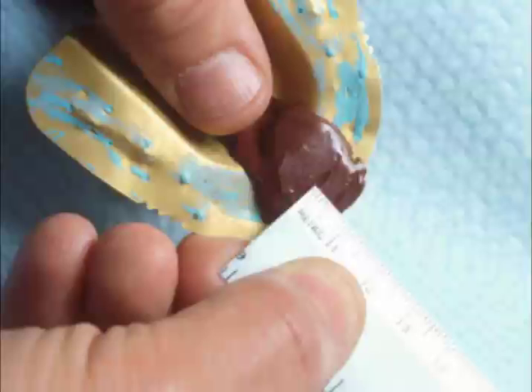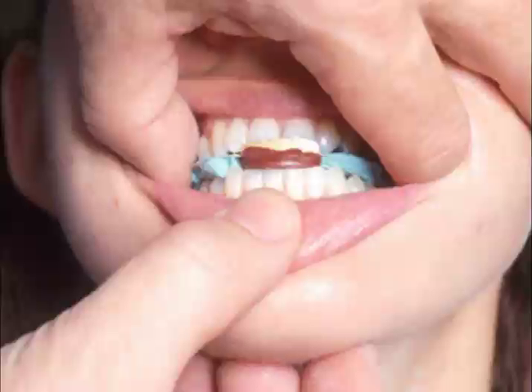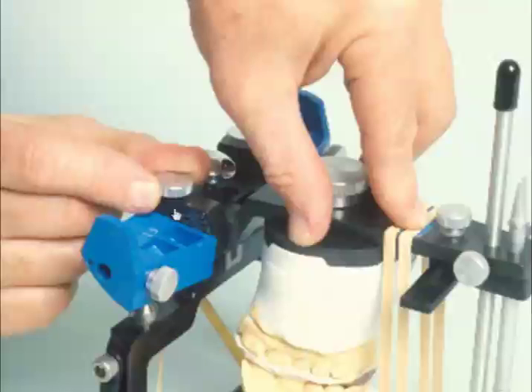And we also know that the record that has 2 indexes in it is our protrusive record, while the one that only has 1 index is our centric record. We can then add the bite registration material to the lower posterior half of the bite tray, go back in the patient's mouth, guiding them back to that edge-to-edge protrusive movement, and then holding the tray in place while the material sets. We can then take that tray to the articulator and move the lower frame and the cast downward and forward to that edge-to-edge position, and we can now loosen the screw, allowing the guide system of the articulator to fall down to where that axis element is moved downward and forward in the fossa, setting the patient's protrusive pathway.